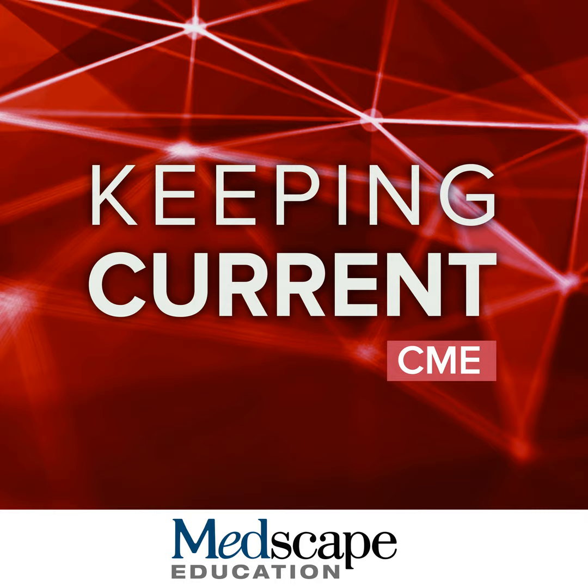And the thought process is much like in BI-RADS in breast imaging. In breast imaging, you do have screeners, then you have diags. And so in this case, the thought is that you have these screening MRIs, these abbreviated MRIs, and then if you're positive, then you go on to a diagnostic MRI.